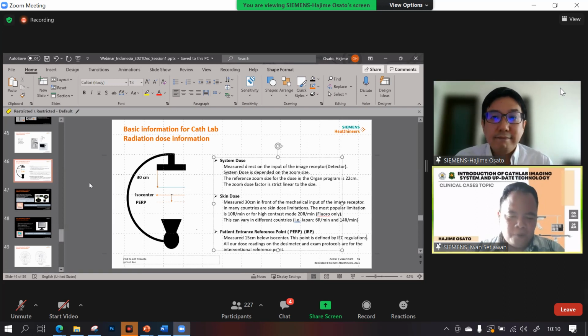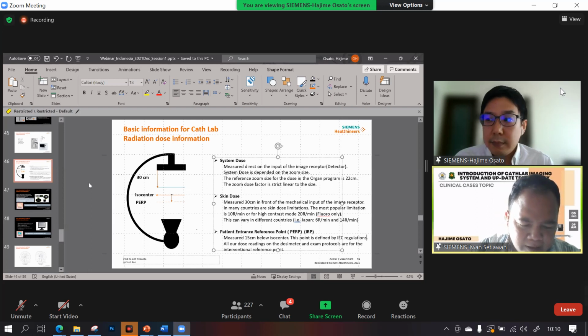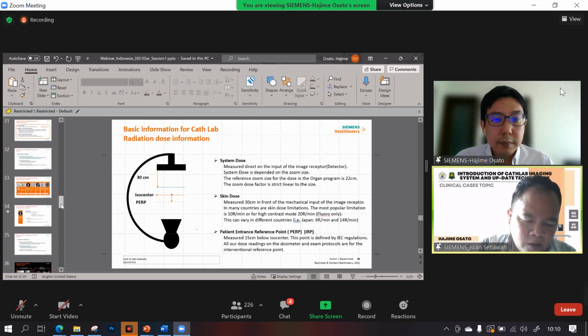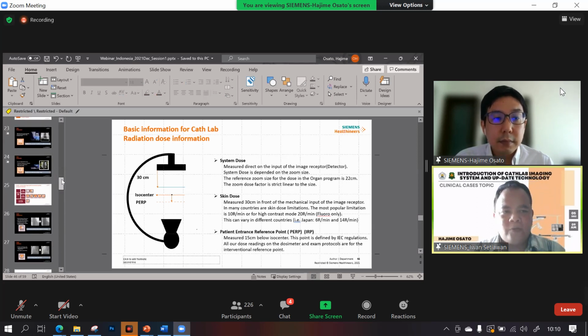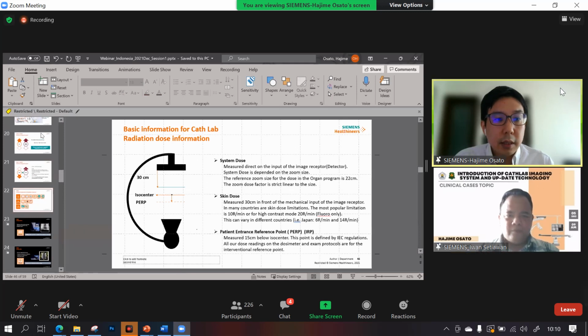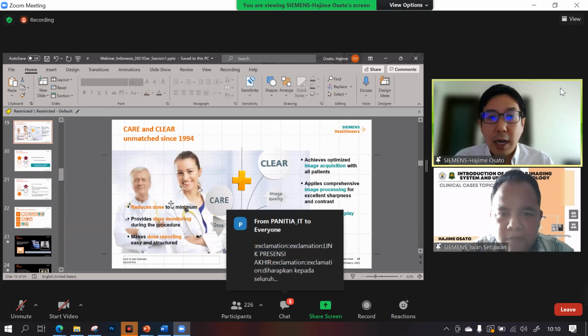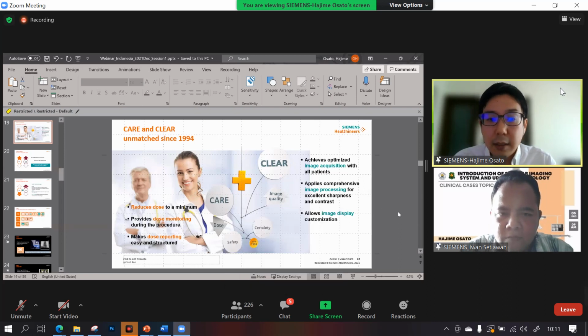Okay, Hazime. We have the next question from Mr. Angri Ihsan. Good morning, Mr. Hazime. Can I ask you a question? Is the Care and Clear technology integrated for the Siemens system only, or for other systems also? Care and Clear is not an option. It is on our Artis Zee and Artis products. All the time, Care and Clear is already installed.